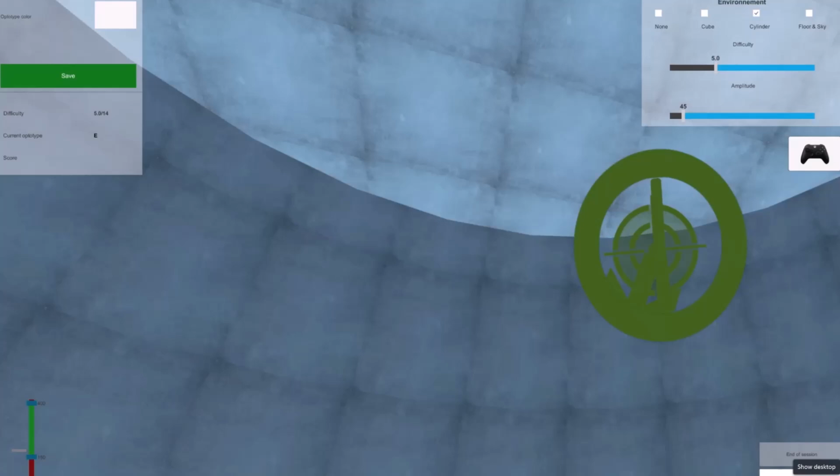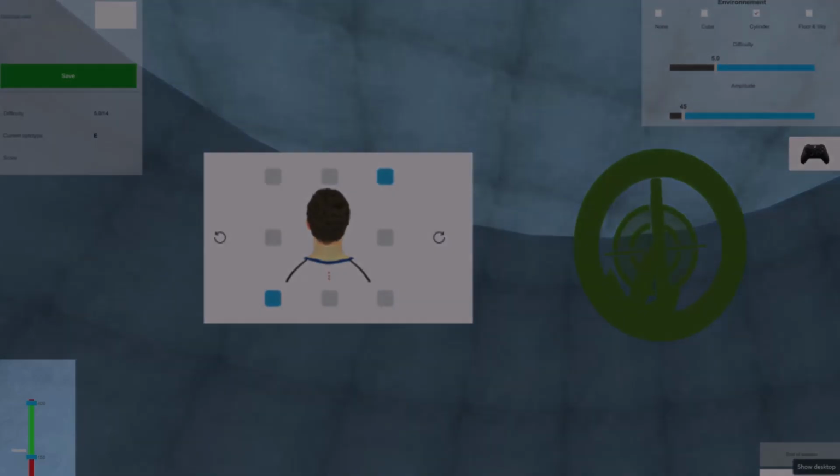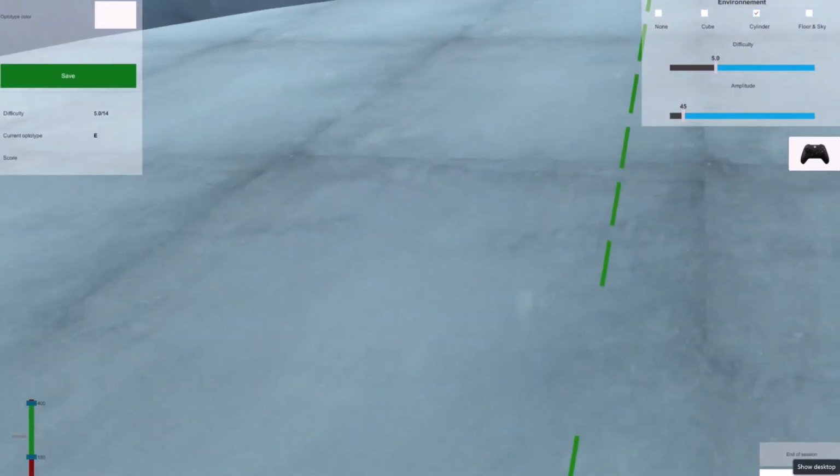So I really like using technology, specifically virtual reality. I can immerse the patient in these daily activities, have them perform specific head movements based on fvHIT results, as well as set the speed. Let's look at a quick virtual reality exercise where this patient is immersed in this environment. Let's say on the fvHIT, they had deficits in the RALP planes. I could set the head movements specifically in the RALP plane, and I could set the speed at where that patient needs to start that exercise.